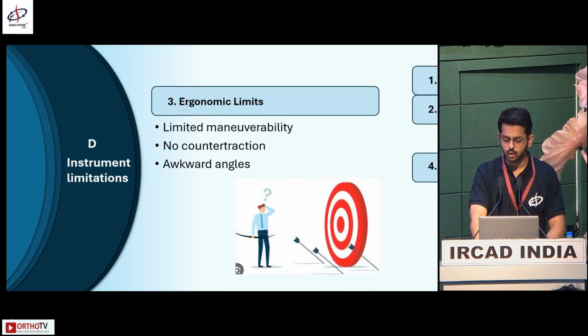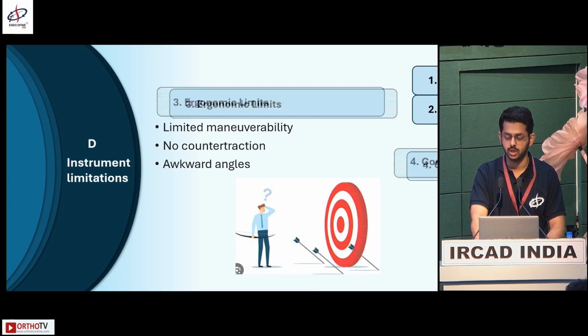In monoportal endoscopy, the non-dominant hand holds the endoscope, leaving only one hand for all the surgical maneuvers. This limits retraction and efficiency, especially in complex cases. In difficult anatomy, awkward angles and limited mobility can make some decompression inefficient or incomplete.